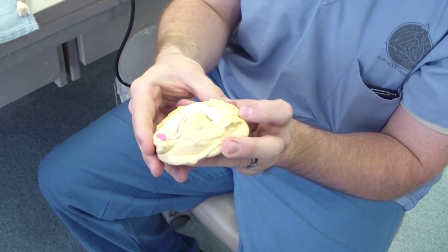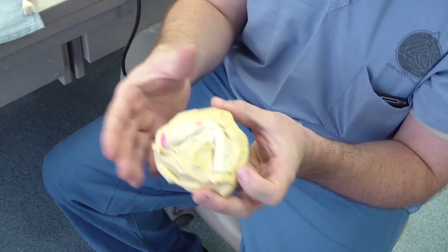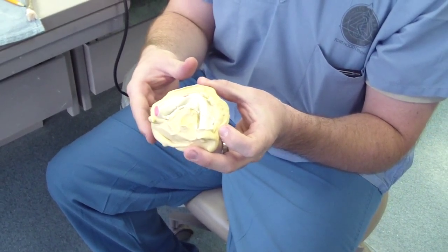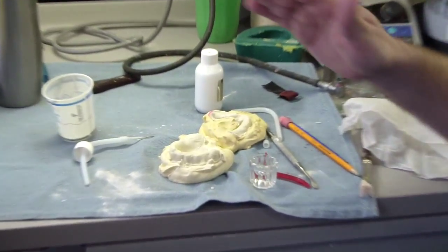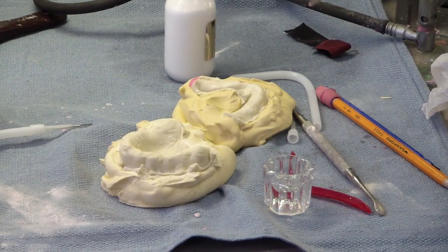And then remove the dentures and give them back. This is a good way to do it if a patient has a problem with gagging or has a problem with taking an impression. So what we're going to be doing now with Mr. Bates is a sprinkle technique with Orpho resin to make the custom trays.